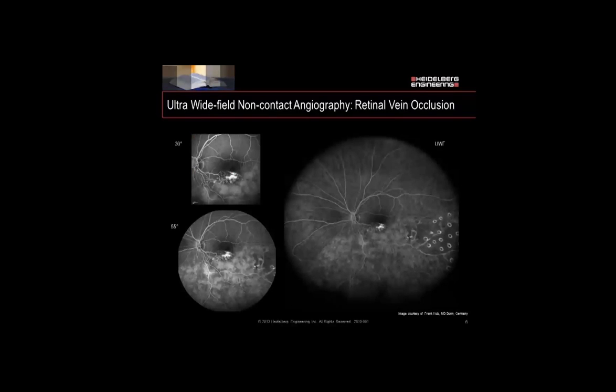In comparison, here are our three options for non-contact Ultra Wide Field angiography. We have our 30-degree field view at the upper left, our 55-degree image below that, and our Ultra Wide Field image on the right.